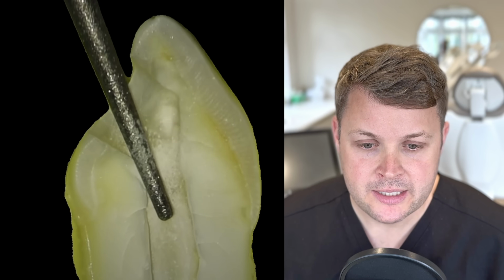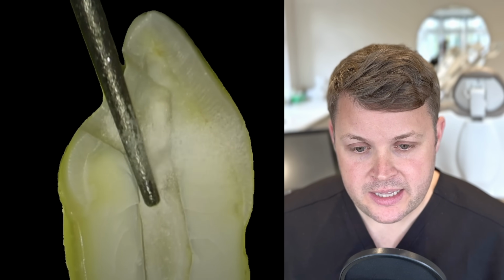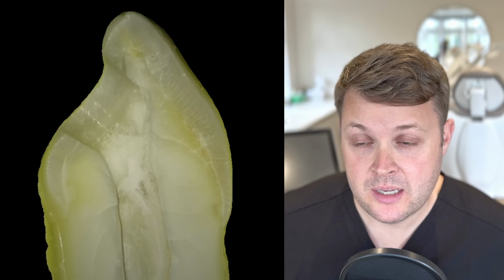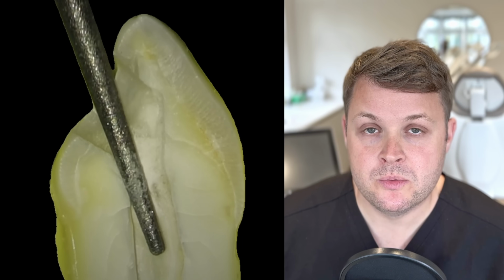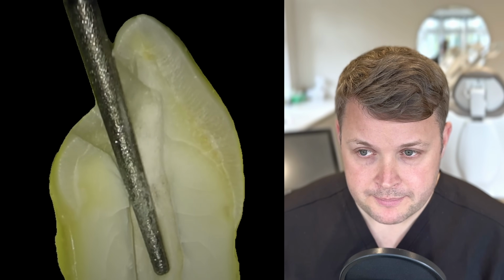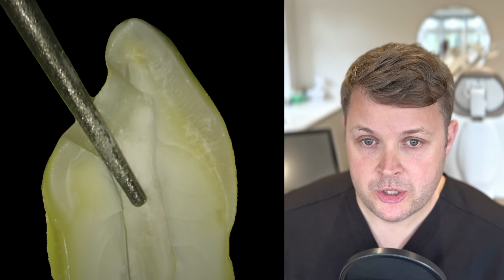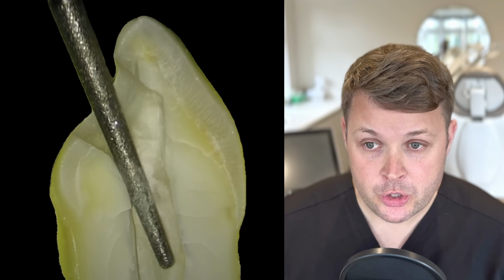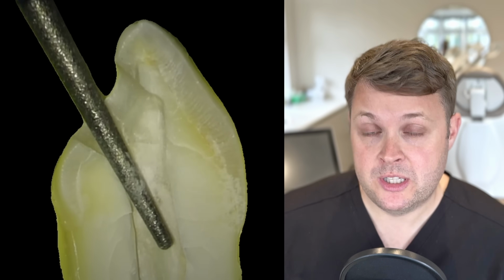So what I wanted to do is address the elephant in the room, shall we say, regarding access of upper anteriors. And in this case, because the tooth was a crown, I wanted to limit the removal of tooth tissue as much as possible. But I want to show you today there are negotiables and non-negotiables when we're talking about access. The non-negotiables are the things that have to be done to ensure that you can clean the tooth appropriately, but then there's a bit of a blurred line, shall we say, with regard to access.